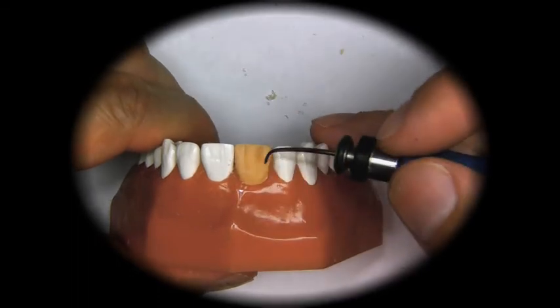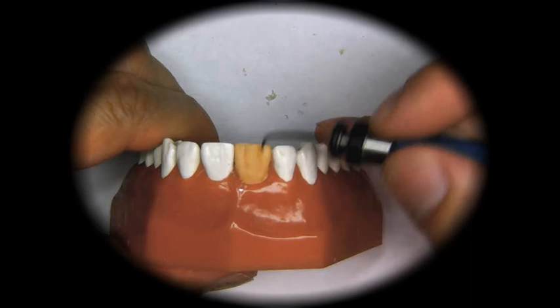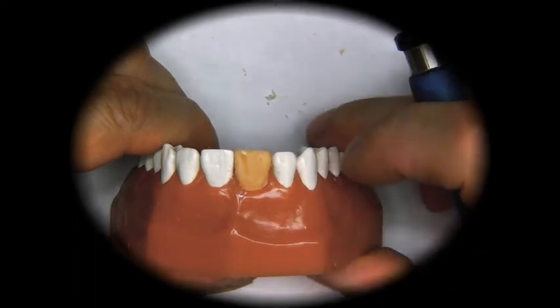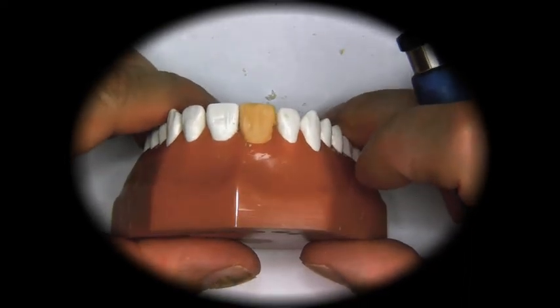Then we're going to blend the developmental groove, which joins them. And there's most of your shaping right there.